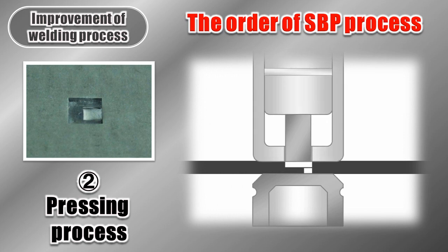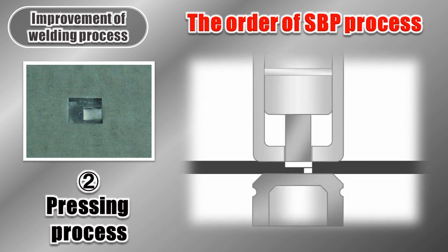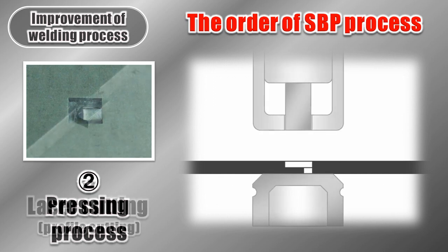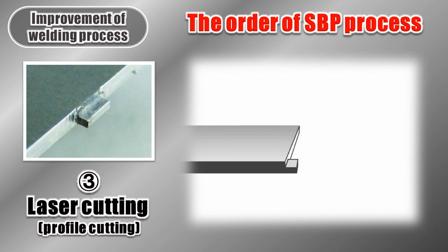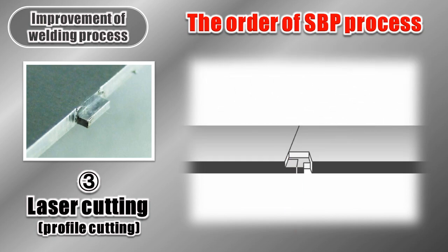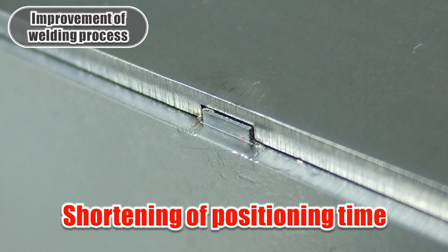Second process is pressing with a special tool. The square hole in the first process is made to avoid the material from deforming during the pressing process. The third process is cutting the profile into tab shape with a laser. This positioning method not only speeds up the positioning process, but improves the precision as well.